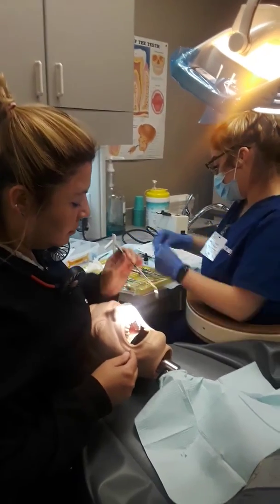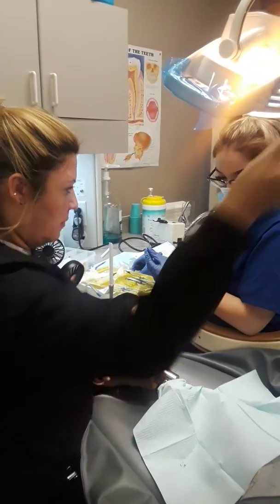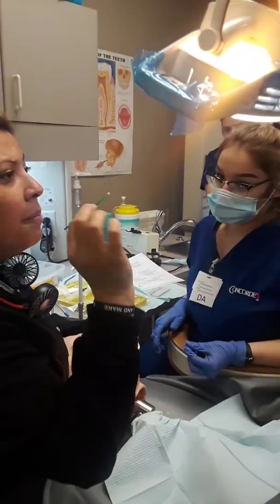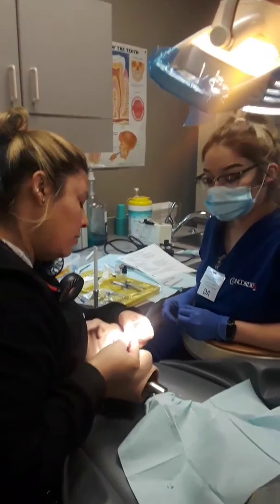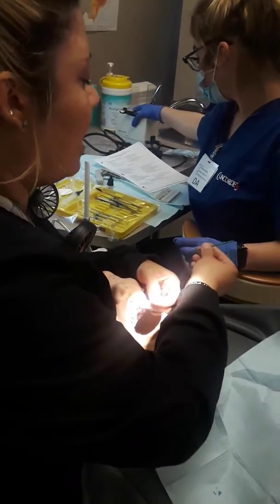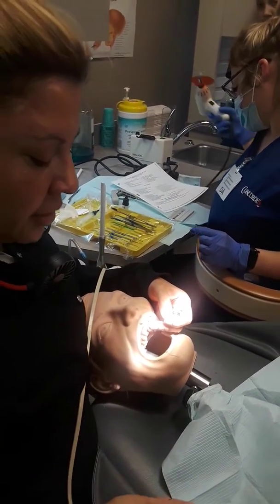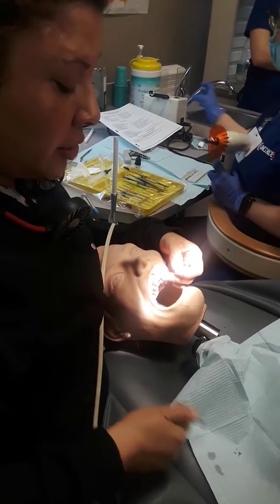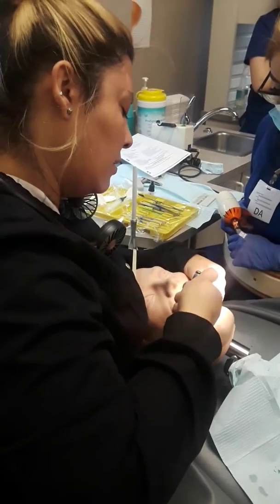Pass brush and bonding material. You can dim the curing light — that's bright, that's dim. She pre-dipped my brush but I'm picky — make sure the brush is loaded. I'm going to add bond to my prep. Then thin it out with air: put the air-water syringe on the bib first to make sure only air comes out, then lightly dash with air to thin it out.